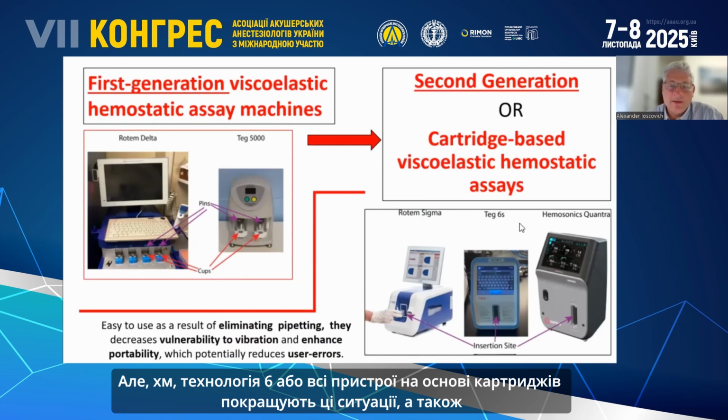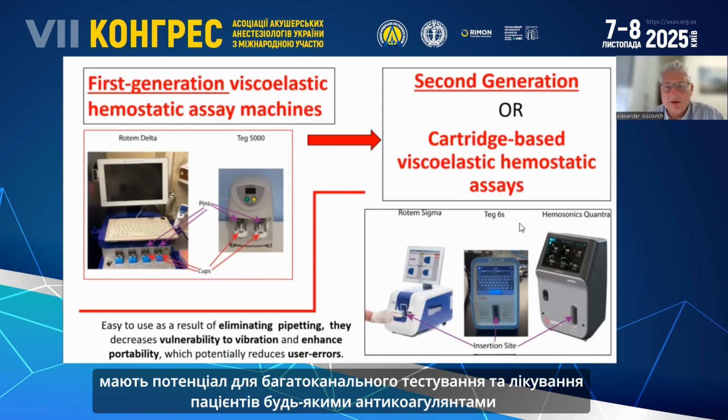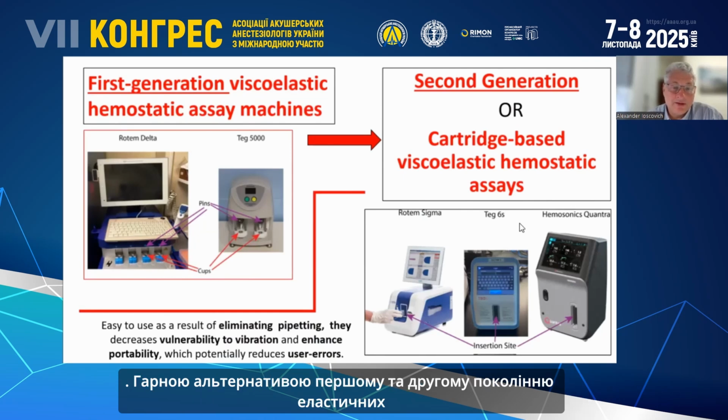They also have the potential for multi-channel testing and for patients treated with anticoagulants.